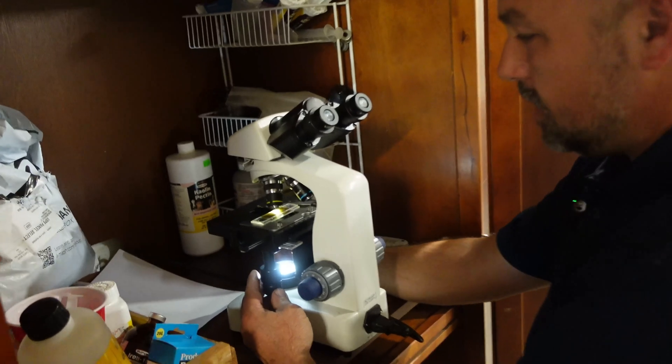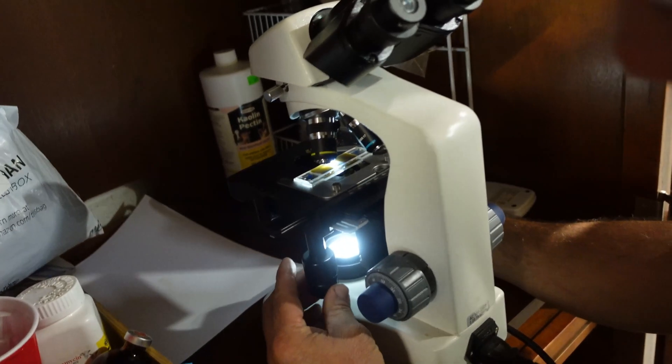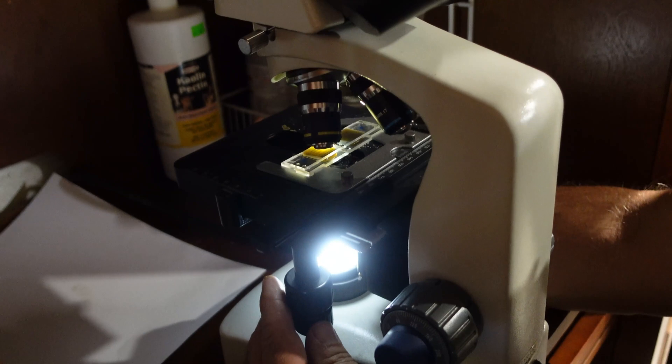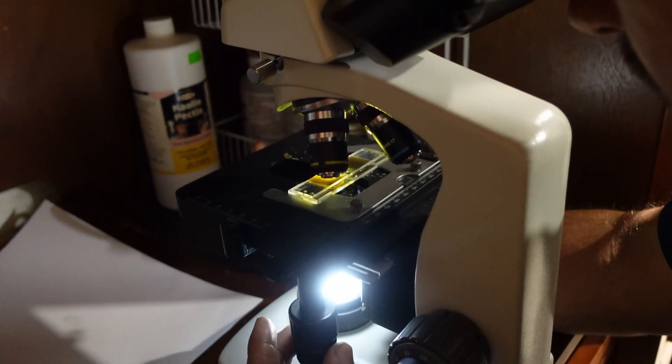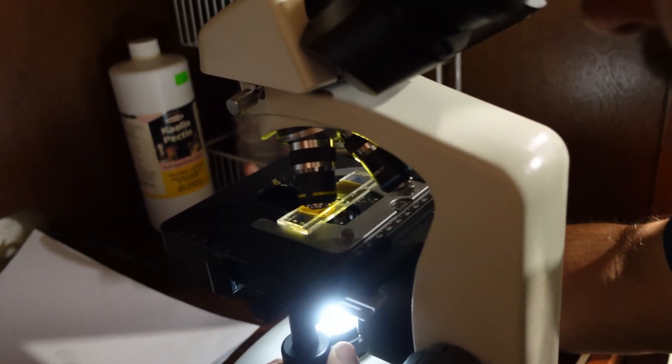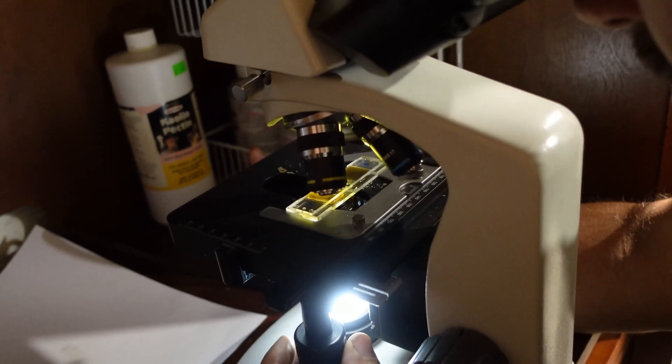In that first set of chambers I've got nine eggs. Now I'm going to move over and repeat that same process for the other half of the slide. Normally they're pretty close. On one side I had nine, the other I had seven — that gave me 16 eggs total. I multiplied that by 25, which gave me 400 eggs per gram.